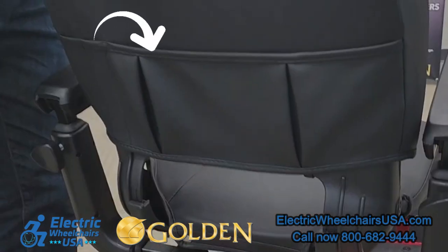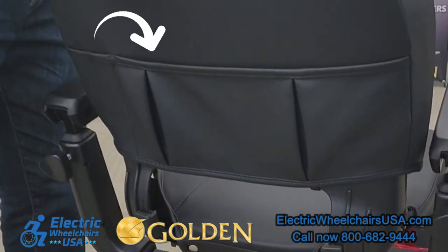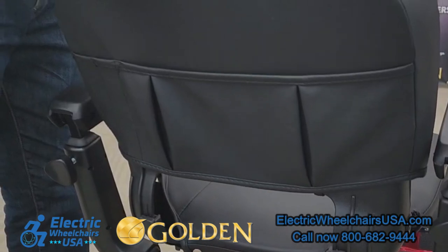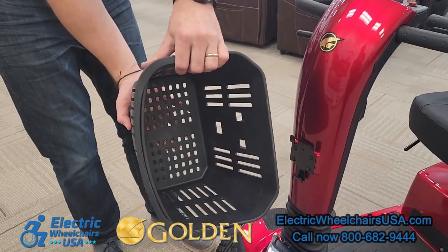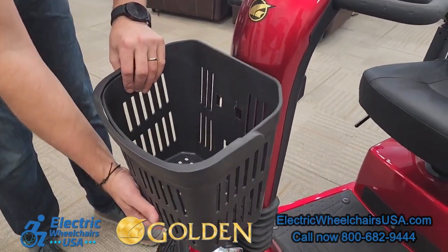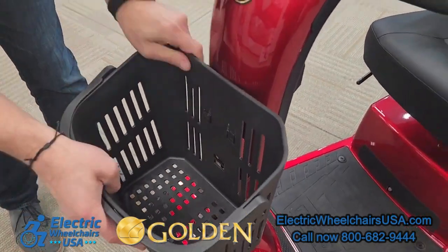On the back of the seat, there is a storage pouch where you can put your charger or other belongings. For added storage, on the front of the scooter there is a large front basket that even has a handle you can carry it around with, and it's easy to remove or put back on.